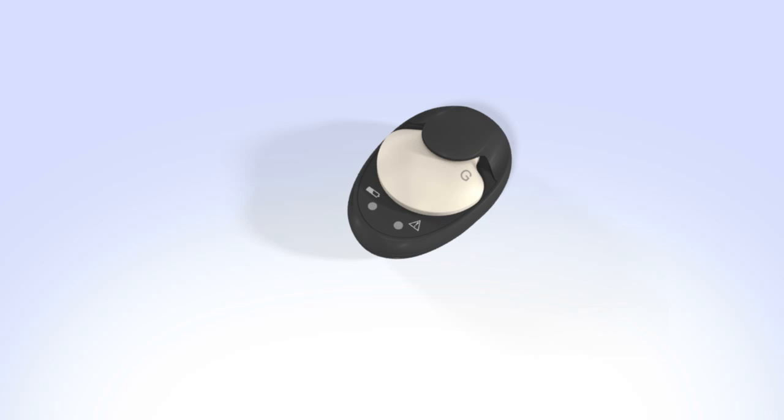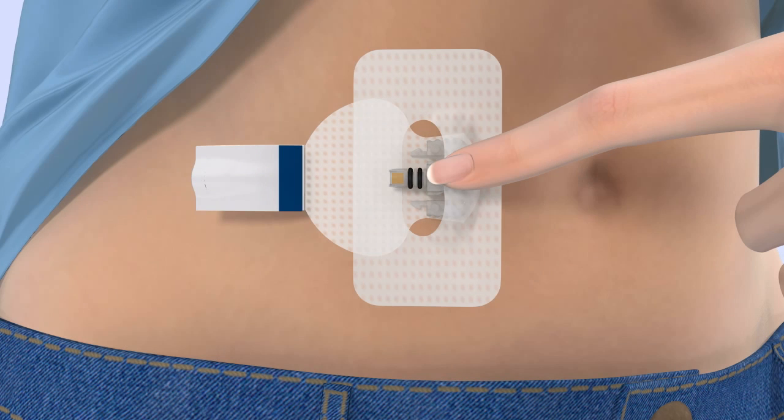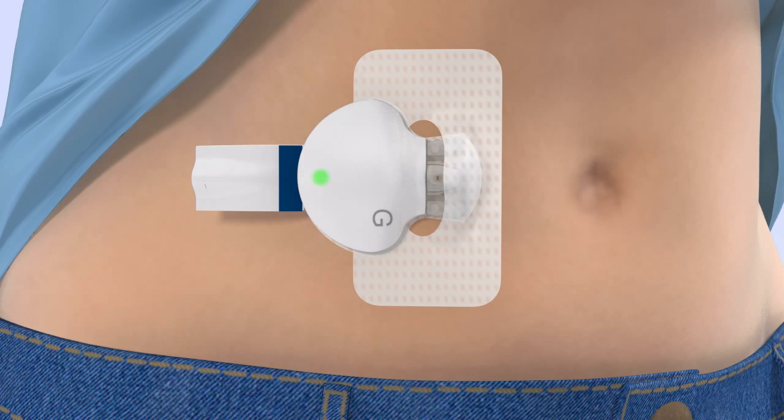To connect the transmitter to your sensor, remove your transmitter from the charger and watch for the green light to flash. With one hand, hold the sensor in place. Hold the transmitter with your other hand and push it onto the sensor — it will click when it is connected. The green light on the transmitter will start flashing within 10 seconds, then flash for a few seconds and turn off. If necessary, use a mirror to see the green light. If the green light does not flash, disconnect the transmitter from the sensor and place it back on the charger until fully charged, then reconnect. Once the transmitter is connected, remove the adhesive liner from the adhesive tab, fold the adhesive tab over, and stick it on the transmitter. Be careful not to pull the adhesive tab too tightly.